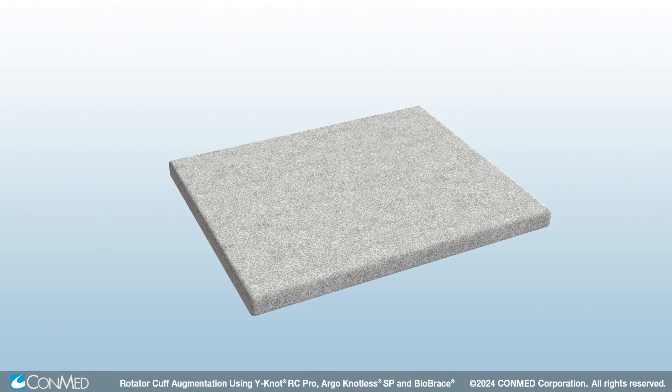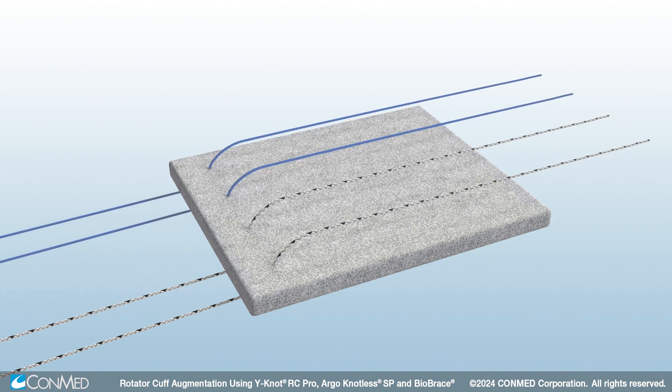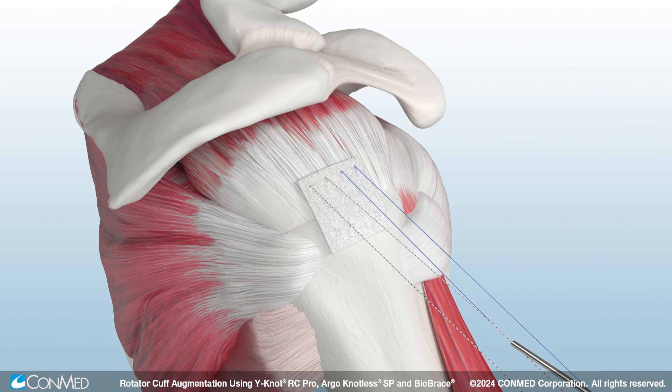Leaving a 5mm border around the edges, pass all four limbs through the leading edge of Biobrace. Use a knot pusher to shuttle Biobrace into place. Then tie each mattress stitch.